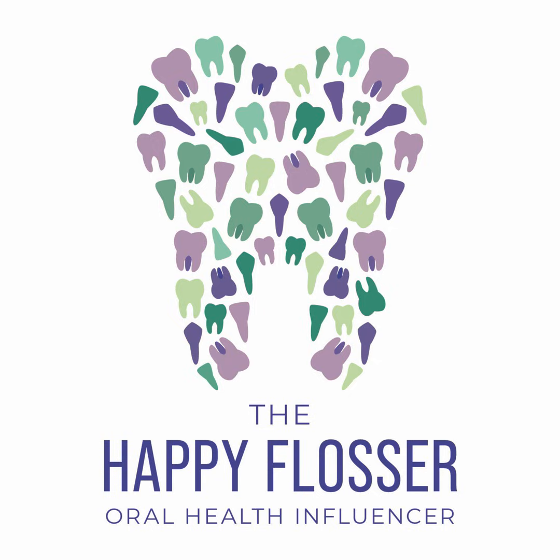Because remember, that maxillary second molar occlusal table is rhomboidal in shape. So you have to accommodate for that shape in order to open up that image and open up that contact. Align the interproximal spaces perpendicular to the sensor. That's what I'm talking about. By doing that minor adjustment, it opens up that contact because your bite wing x-rays have to have open contacts in order for them to be diagnostic in nature.